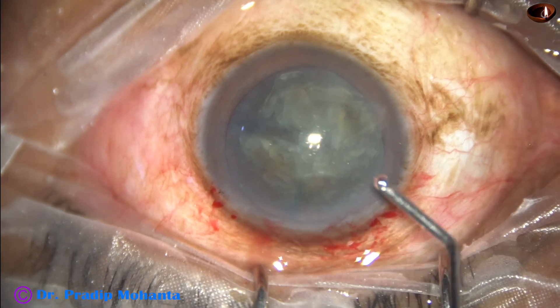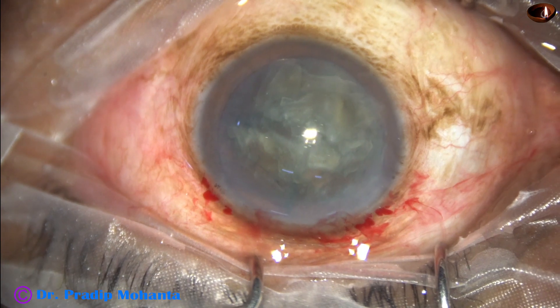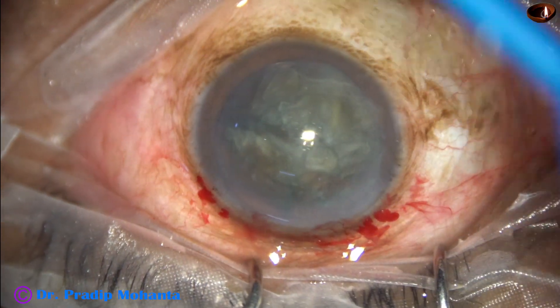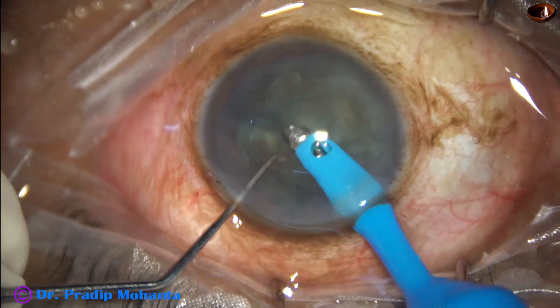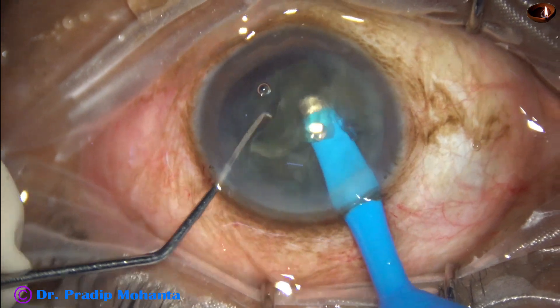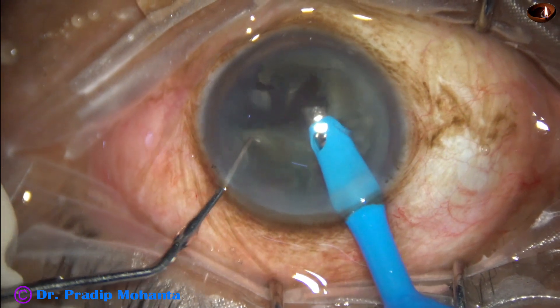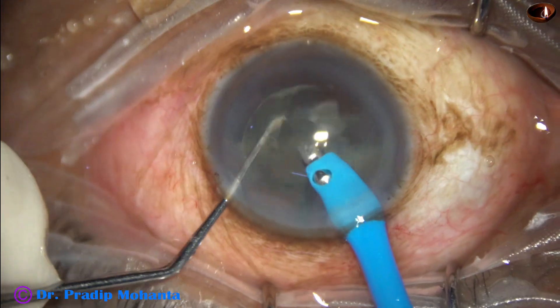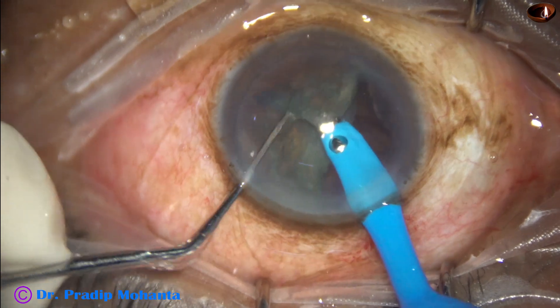The anterior chamber is again filled up with visco and the handpiece now goes in. Since the nucleus is already chopped, we simply start picking up the nuclear fragments and emulsify the pieces. Ultrasonic energy in this case is 50%, flow rate is 40, and vacuum is 400 mmHg.